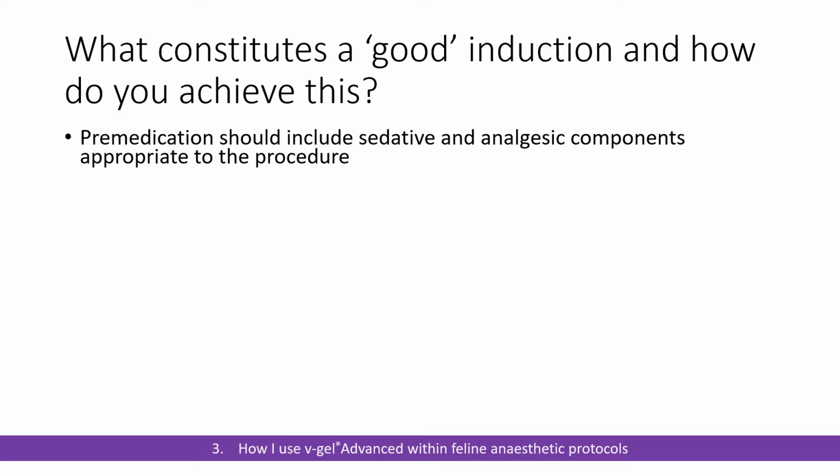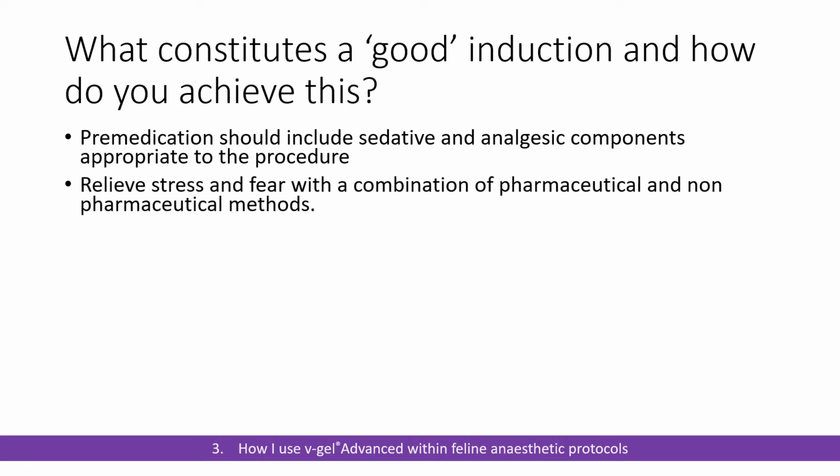So you need to think about what problems the procedure is going to throw up, and then put drugs into your pre-medication that are appropriate to that.